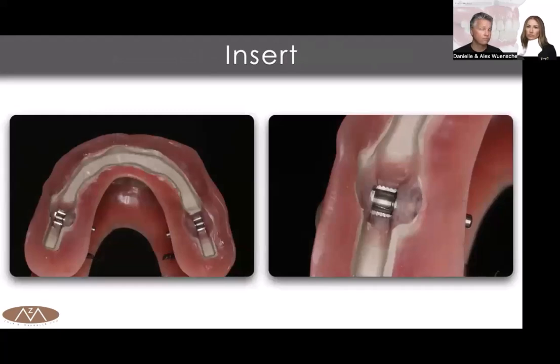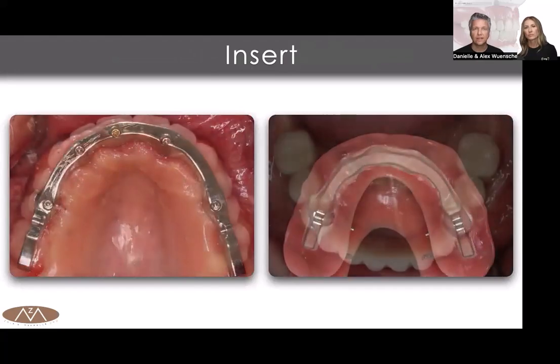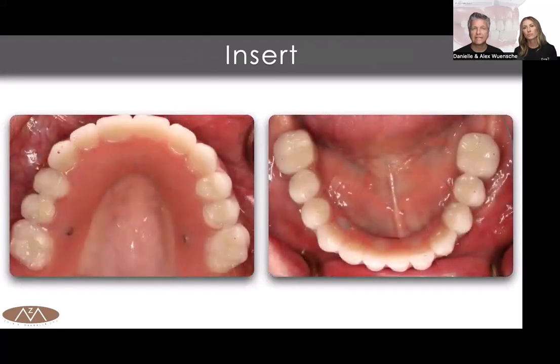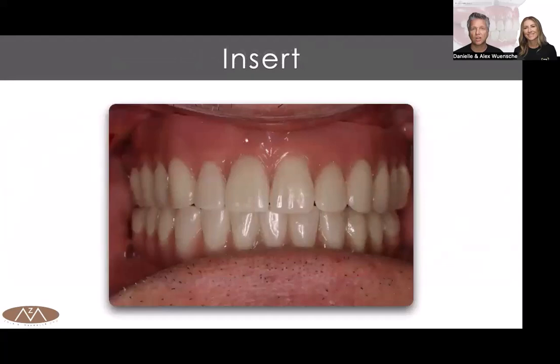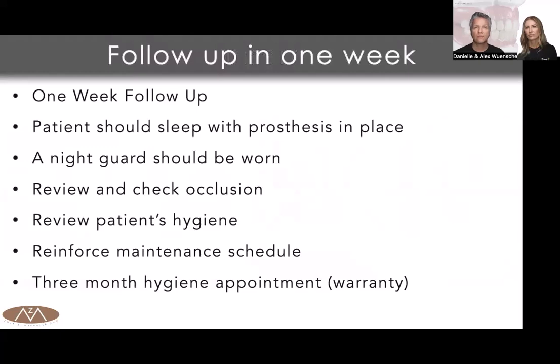That's the insert, that's the processed case here. Here is the intraoral view, and we have the case seated. Usually the seating appointments are quick in the mouth here, and we see these little holes on the side. You see, I told you guys we're going to explain how the case goes in and out, and these holes have a certain functionality for a little tool we need for that specific attachment.